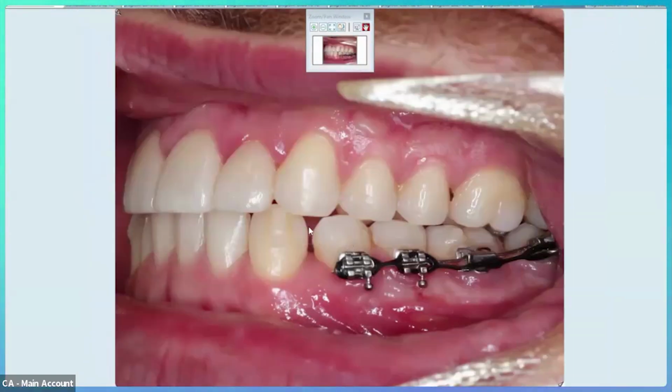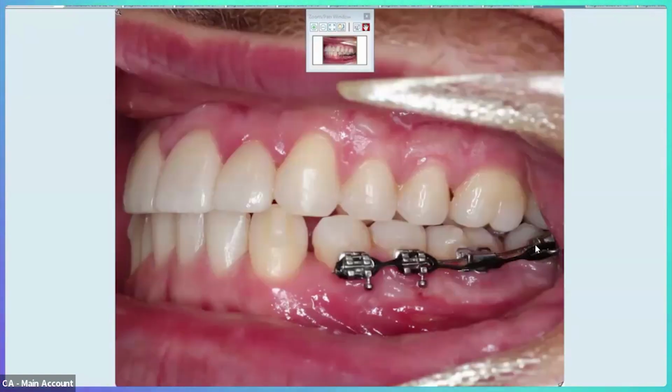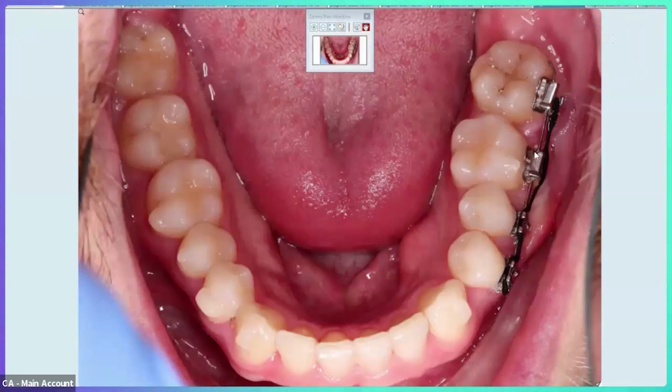But what you're going to notice is that even with us wearing the aligners in the anterior and trying to lock these teeth all in, there is a space that opens up, because as these teeth are all pulling back and uprighting that tooth, there's a reciprocal force that's happening. And because the tray didn't lock in that well to the anterior teeth, they did pull back slightly. But again, guys, if you right now had this case, where there's a bit of rotation, there's a bit of a distal out, and you had a little space there, and that was the patient's chief complaint and they wanted aligners, would you feel comfortable saying, yeah, I can go ahead and close the space between the canine and the premolar and rotate a second molar a bit?